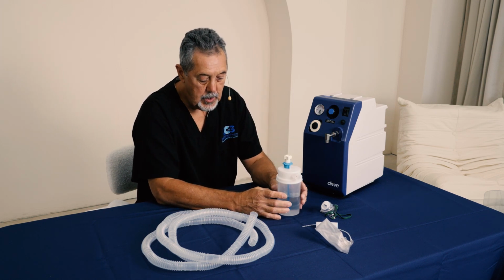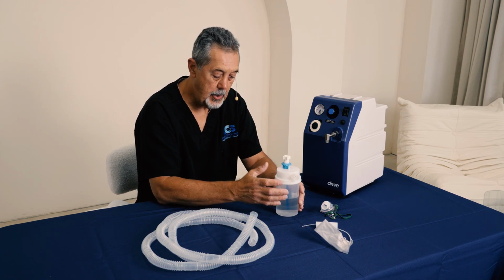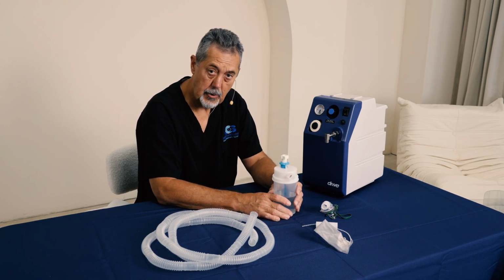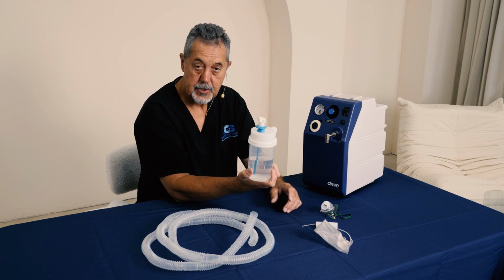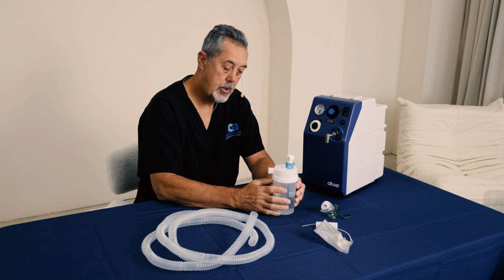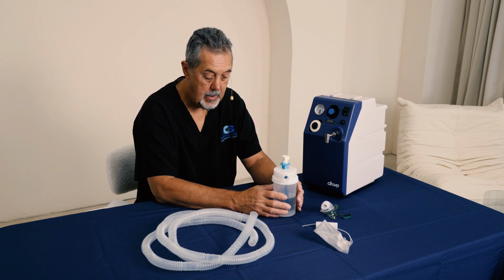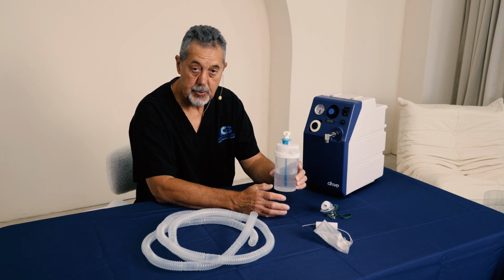So what you want to do once a week, if you need to clean it, because you don't have another one to replace it, you're going to use a basic dishwashing soap, no lotion, no moisturizer, no fragrance, and you're going to wash this inside and out with soapy water and rinse it well. After that, you're going to want to soak this in a 1-part vinegar, 3-part water solution, that's white vinegar. Soak it 15 to 20 minutes, and then rinse well.